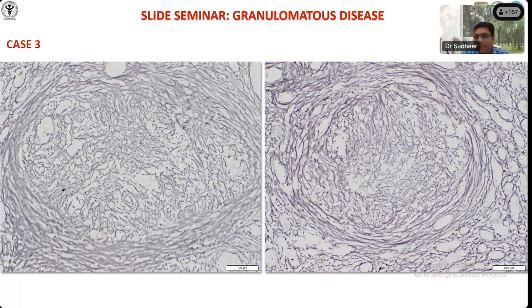There's one thing. Two people have asked why not vasculitis. You can tell them that in vasculitis there will be a lot more neutrophils, and the necrosis is a little more bluish. You will not get it like this very commonly in sarcoid; very rarely it looks like this. Is it located at the periphery of the vessel, not destroying the vessels? For it to be vasculitis, the inflammation should destroy the vessel wall, and you will also get fibrinoid necrosis, neutrophils and other things. Even in sarcoidosis you may see lymphocytic vasculitis also, but the necrosis of the vessel wall will not be there.